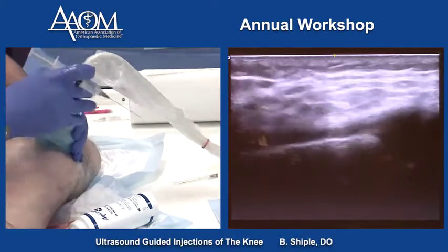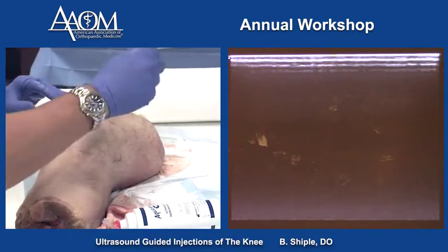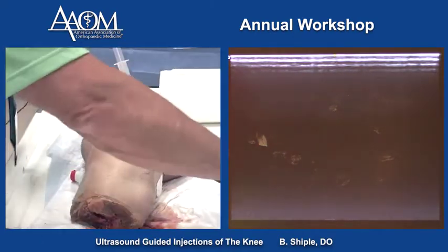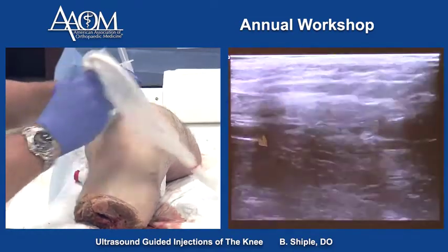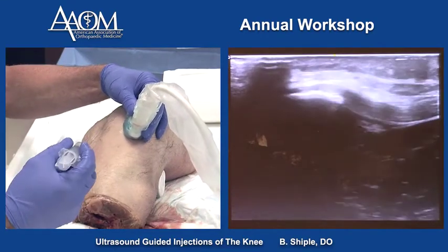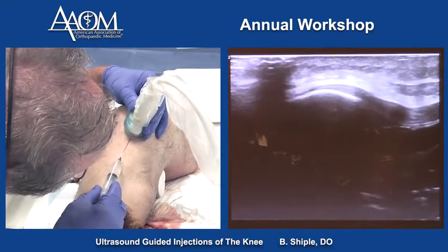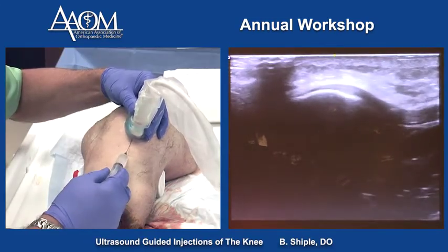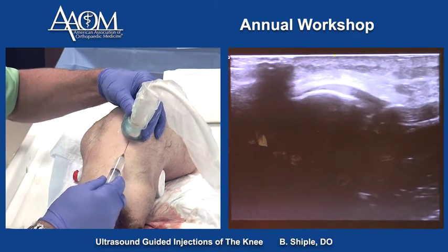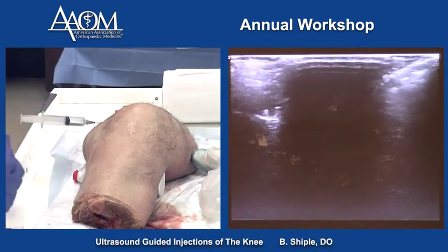The last one is the patellar tendon. We'll put the patient's leg in flexion, and this will be a long axis technique. That's my needle tip in the tendon right there. So that's it — that covers most of the targets in the anterior, medial, and lateral knee.